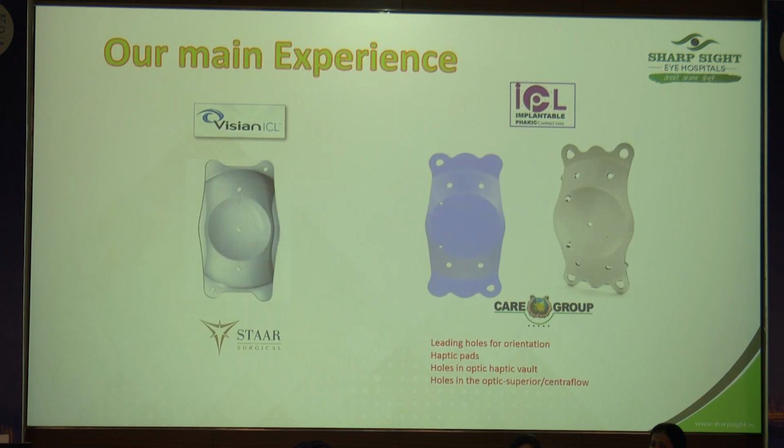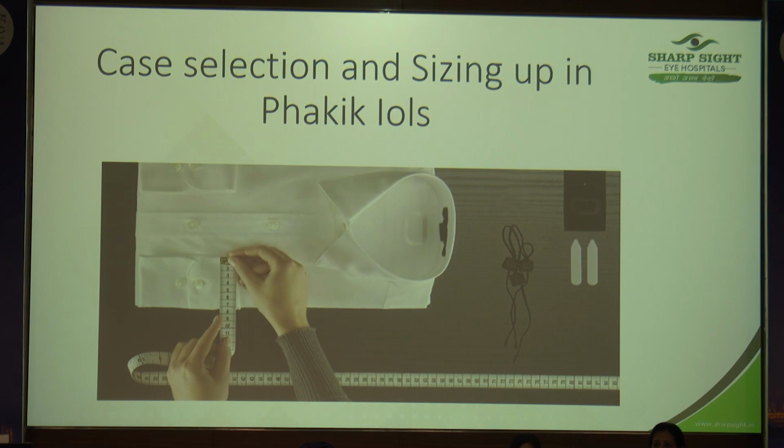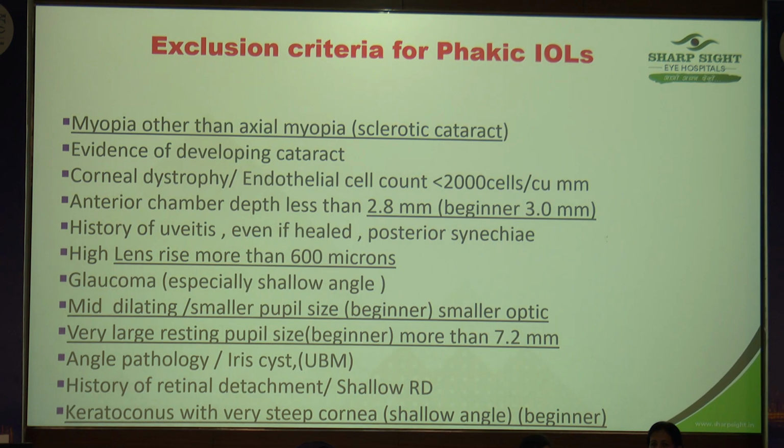My main experience is with the IPCLs. I probably do have the highest experience in IPCLs. Of course, I do a lot of ICLs also. Case selection and sizing up is the main cornerstone of doing a good surgery. Technically, the surgery is not difficult at all. Any good phacosurgeon can practically master the surgery.